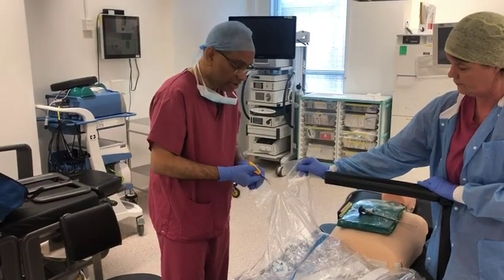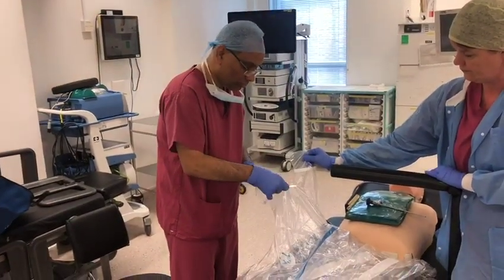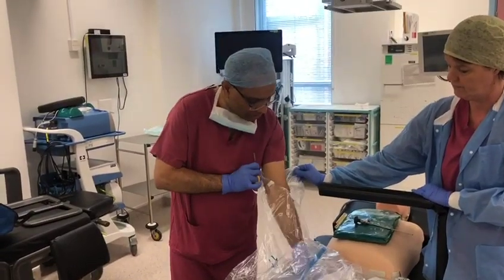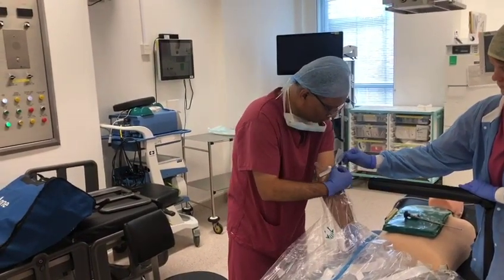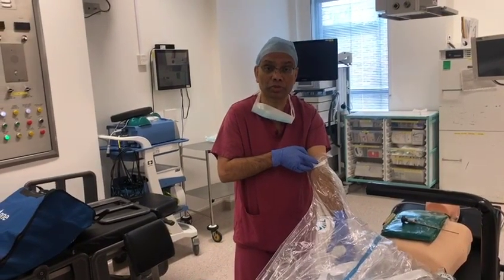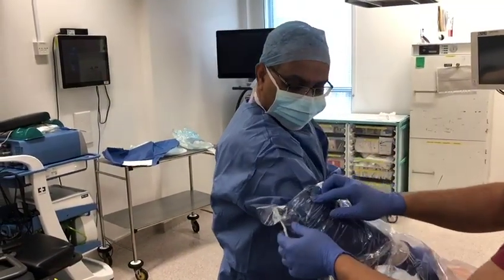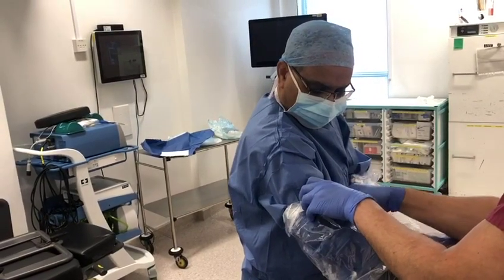You can pull the eye-piece attachments, spread them away, and then make a slit in between them. Once we open the slit, you can slide your arm through the slit as far as you can. Once you're through, you can secure it around your arm. Through that slit, I'm going to slide my hand up to my arm, and then this is closed with the adhesive straps within the drape.